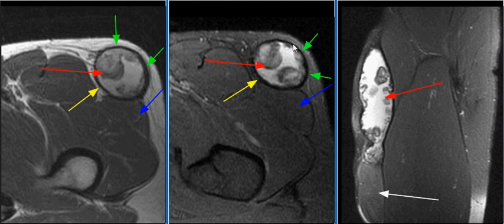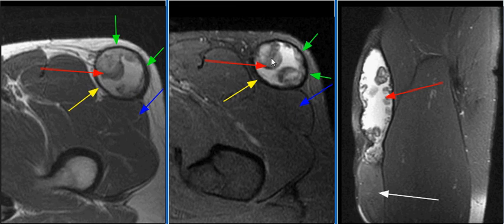The fluid collection has a thick hypointense capsule with internal hyperintensity and signal inhomogeneity, representing a subacute hemorrhage, entrapped fat globules, and internal septations.